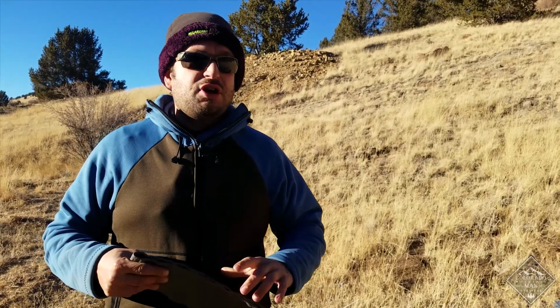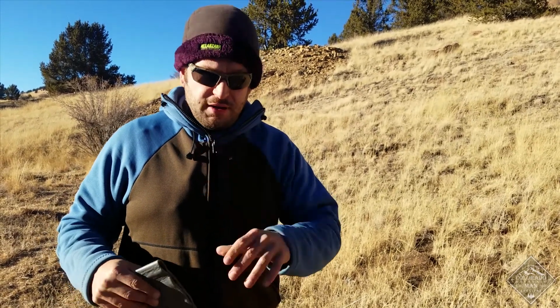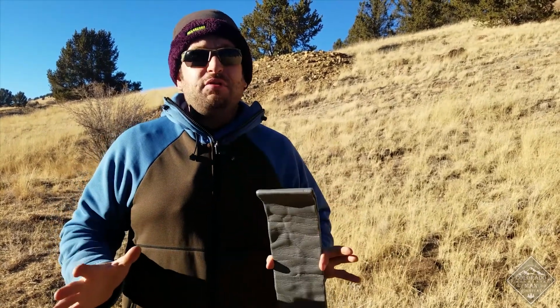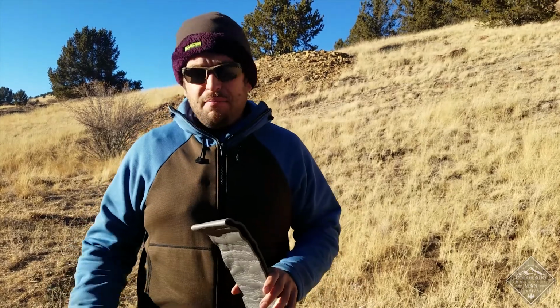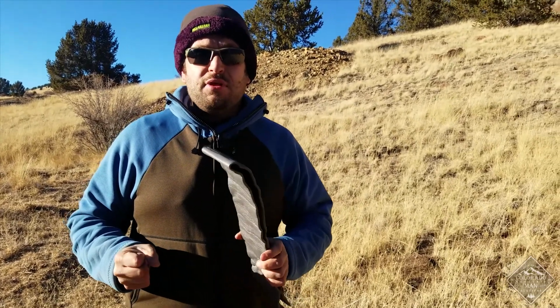If somebody just took a big fall and they're writhing in pain and moving around, you still have to assess them. You're the only one around. They could have a life threat somewhere, but you also have to protect their C-spine. So in most wilderness protocols, you'll see that C-spine immobilization is part of the scene size up. If you get on scene, unless there is a massive bleed that you have to stop, a massive femoral bleed or something, the first thing you want to do is manually immobilize their C-spine.